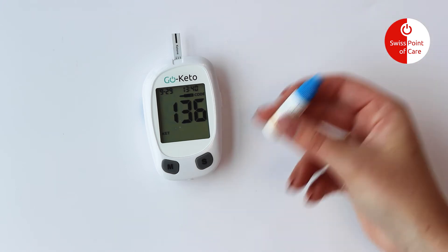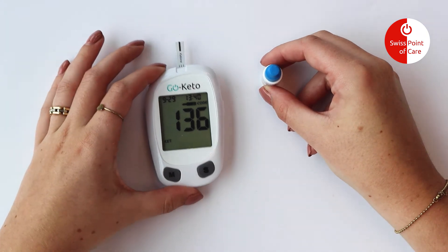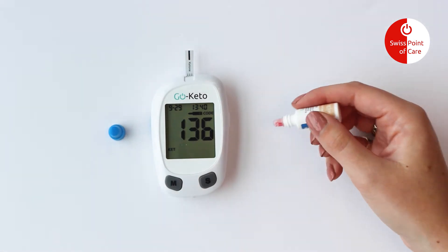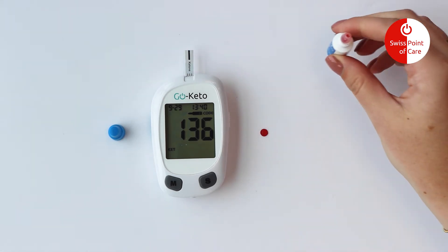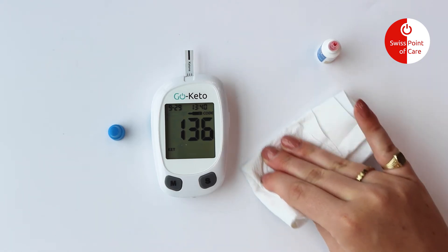Shake the control solution bottle well, then squeeze a drop on a clean, non-absorbent surface. Discard the first drop and squeeze out a second drop.